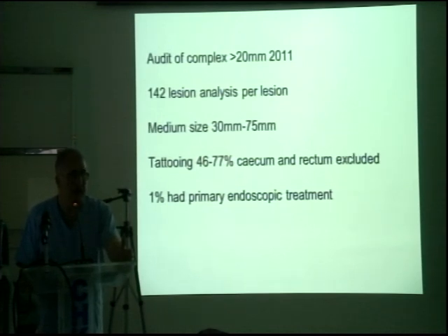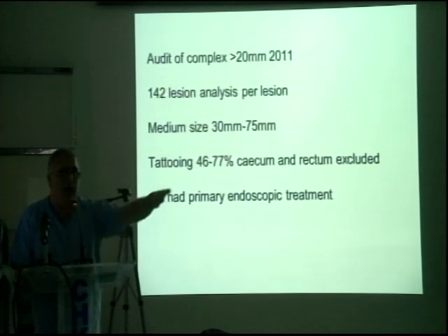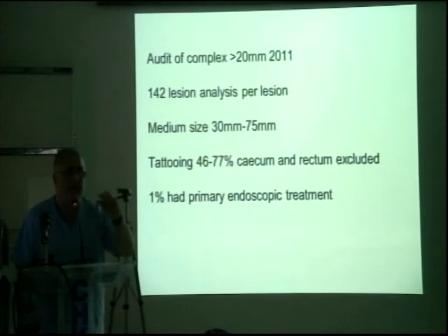It's something I've been saying for the last 15 years. I've never used the mix. I refuse to use it because I actually have been one of the people saying that the adrenaline actually causes ischemia. You have damaged that mucosa, especially in the cecum. You've taken at least 1 millimetre into the wall. It's leaving approximately 1 millimetre of tissue left. Should you have then injected that area with adrenaline and some have gone into that area, you can cause ischemia and there's a potential for delayed perforation. So there is issues about it that I was never happy with, so I didn't use.